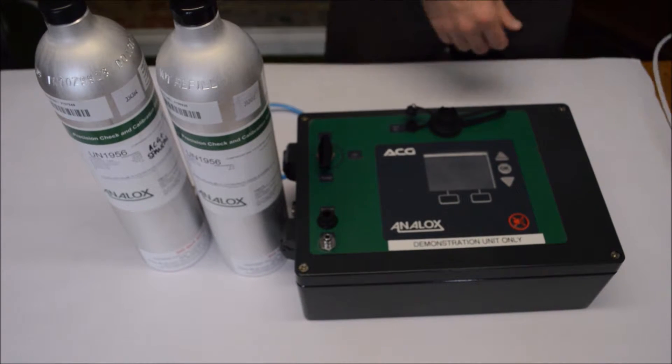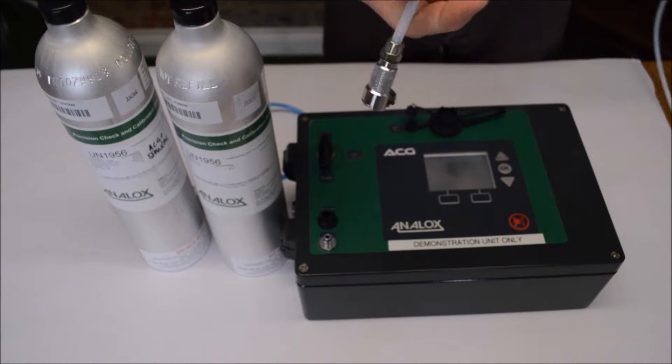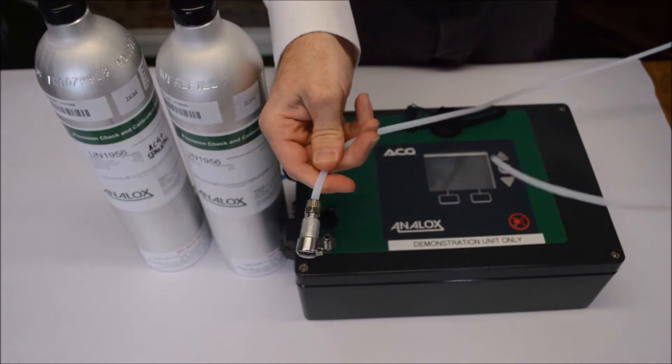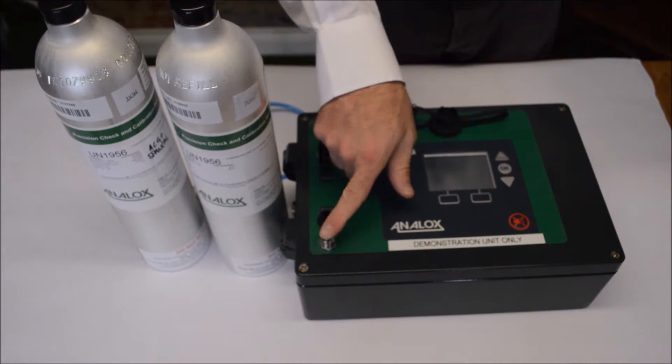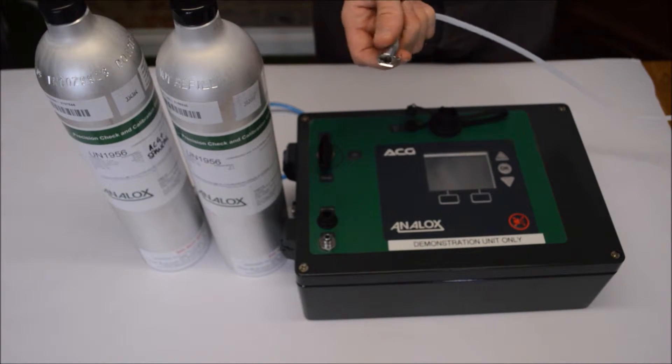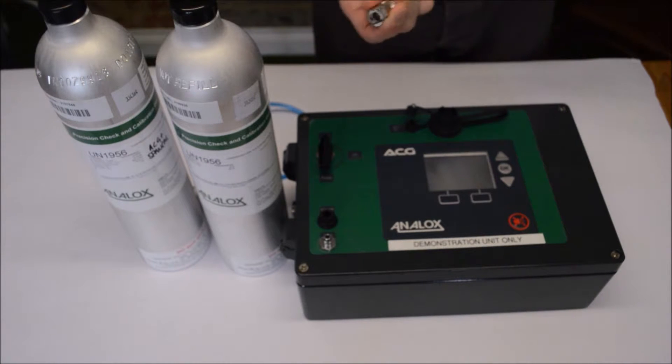We also need our supplied length of PTFE pipe with the Linktech connector, which allows you to connect it onto the ACG unit right here. That's the equipment we need for the calibration and we'll now progress onto the calibration of the unit via the screens.